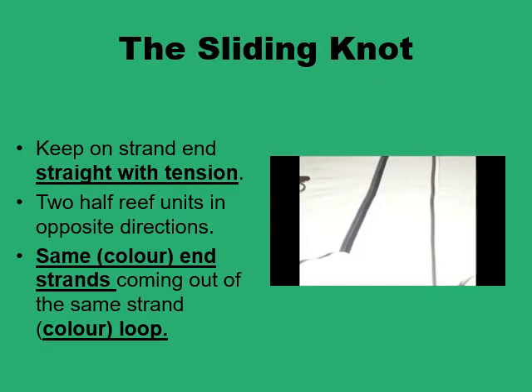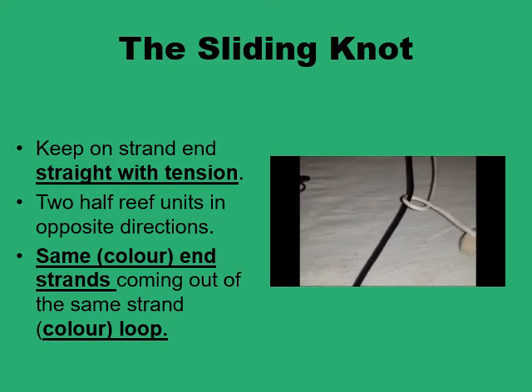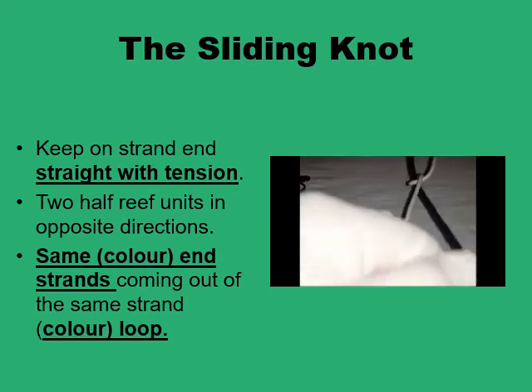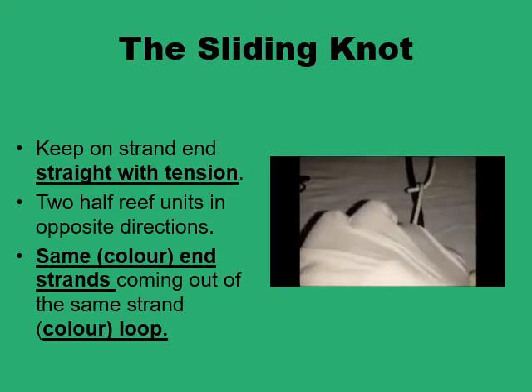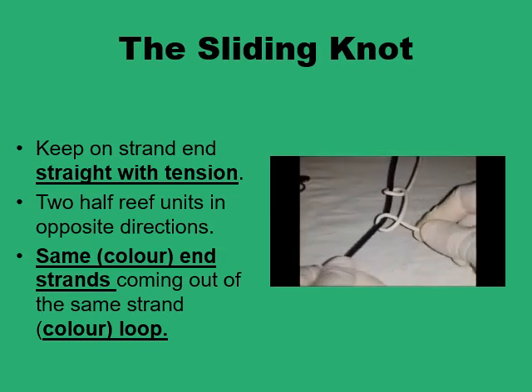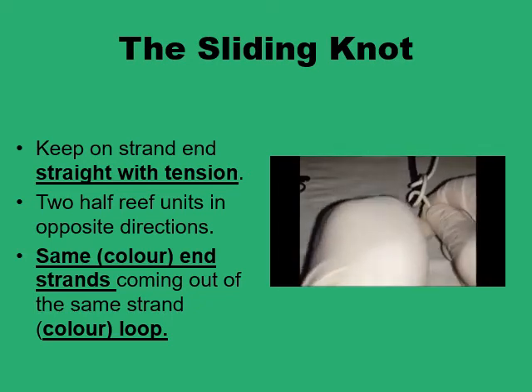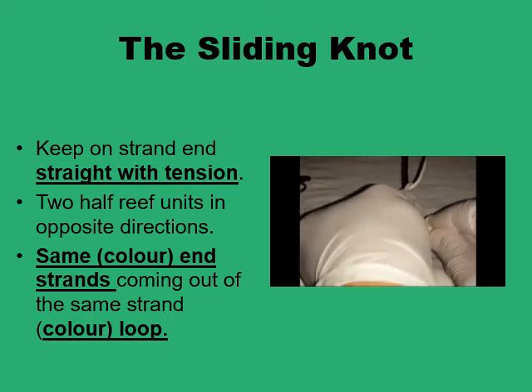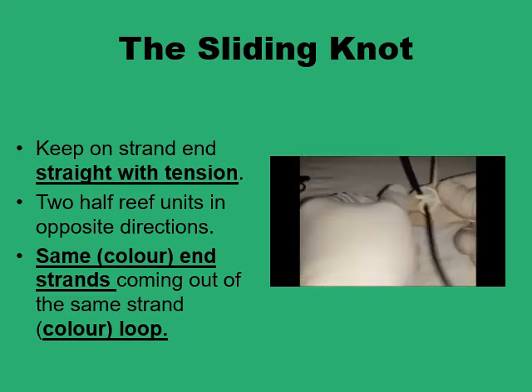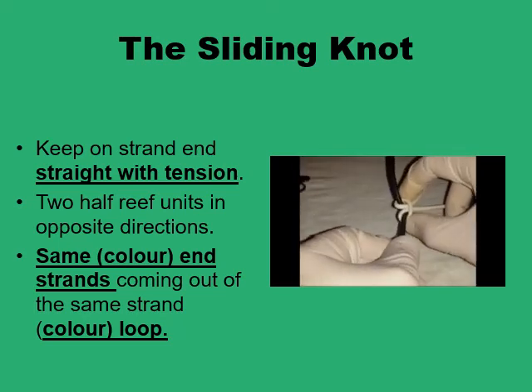This demonstrates how the sliding knot is formed. The two essential things are: keep one end — the black end — straight, and wrap the white end around the black end twice in two opposite directions. Form the first half reef unit in one direction, then the second in the other direction. You now have the sliding knot in position, with an open white loop and the two ends of the white strand coming out on the same side. This knot can slide along the straight black end up or down into the desired position.